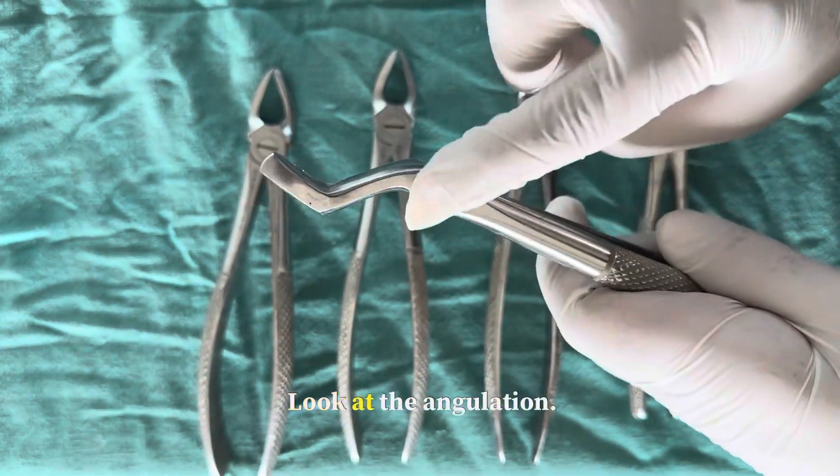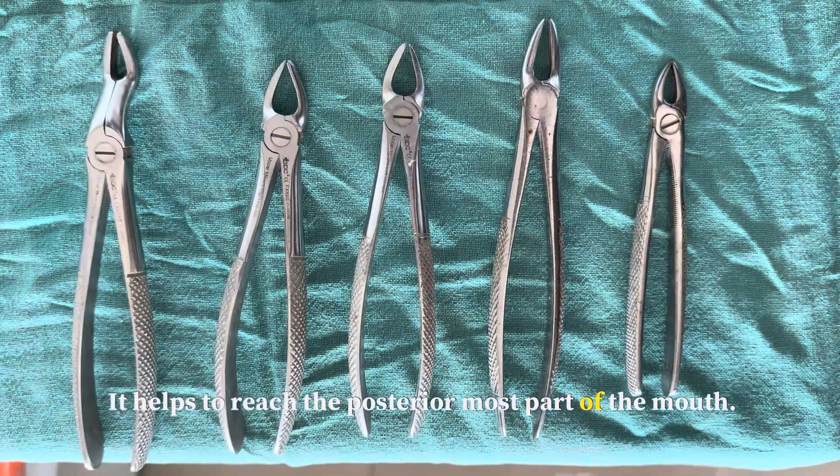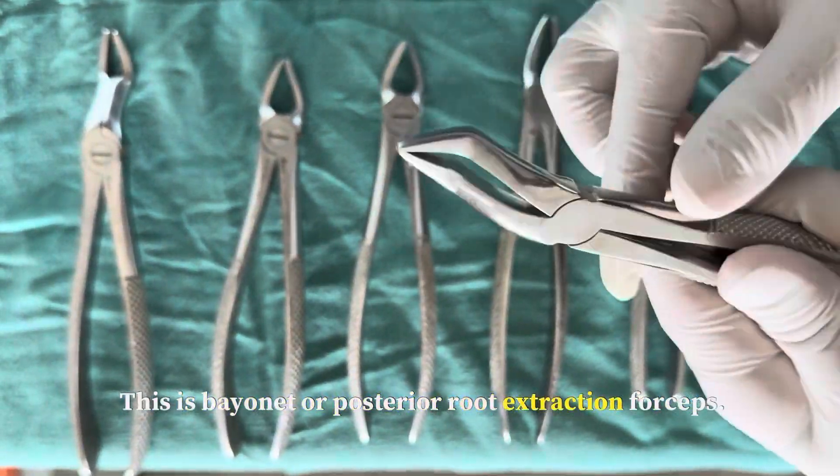This is the third molar forcep. Look at the angulation — it helps to reach the posterior-most part of the mouth. This is the bayonet or posterior root extraction forcep.